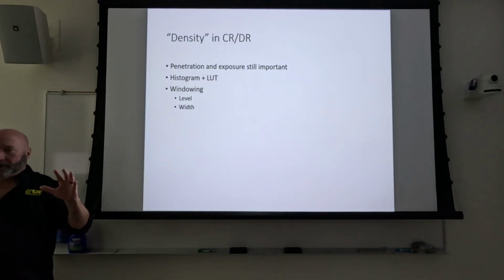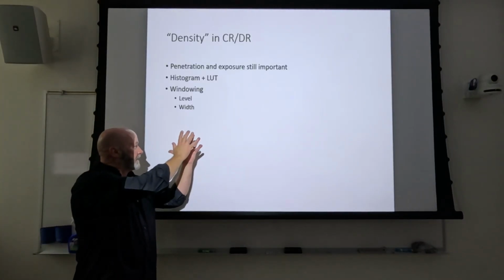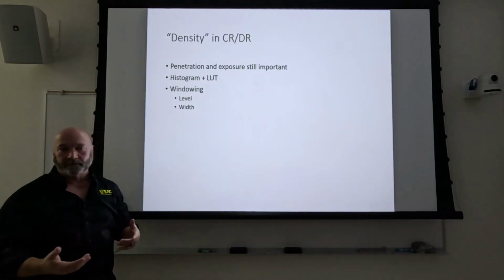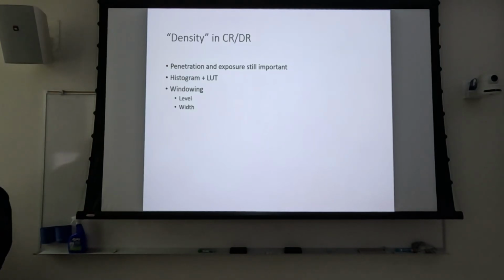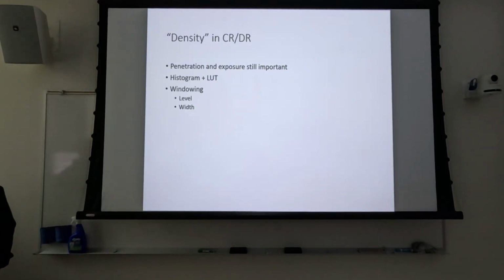And if your histogram has lines that are spread out like that, and the stored one has lines that are like that, what the computer does is it takes and it goes like this so that your contrast and density looks like the one in the computer. It looks ideal. That's why you take an image of somebody's hand and it looks, aside from pathology, like every other hand that you ever shoot, right? It takes care of all of that for you. So that's automatic rescaling.